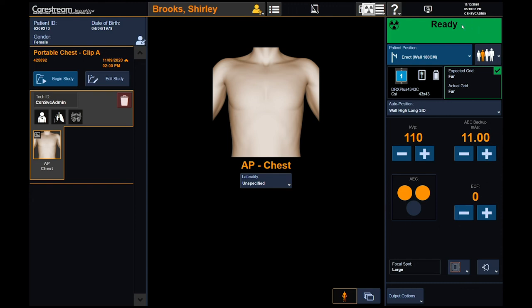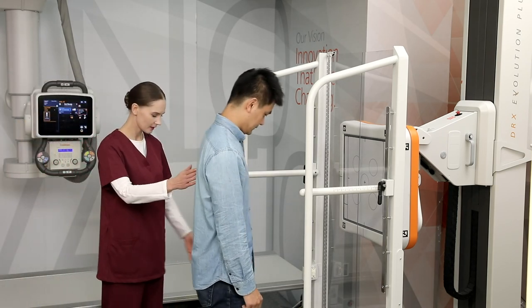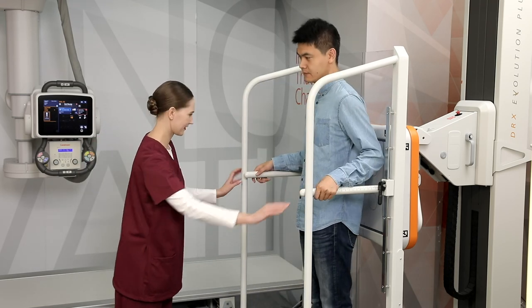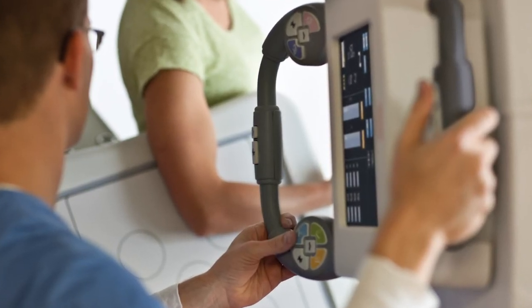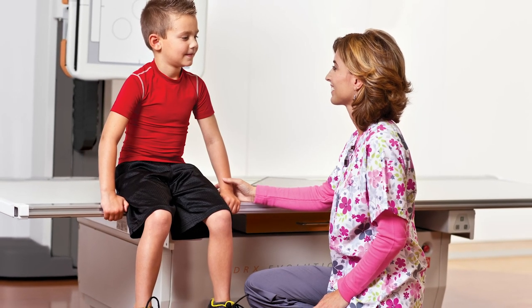Right stage allows manipulation of exposure factors and access to post-processing items. The DRX Evolution Plus has the ability to perform advanced applications such as dual energy, digital tomosynthesis, and automatic long-length imaging exams. CareStream offers remote managing services for 24-7 access to help. The DRX Evolution Plus provides your facility with versatility, scalability, and productivity.